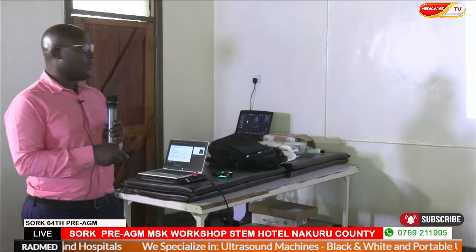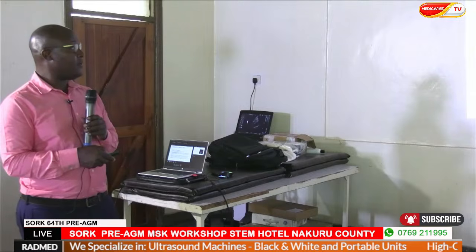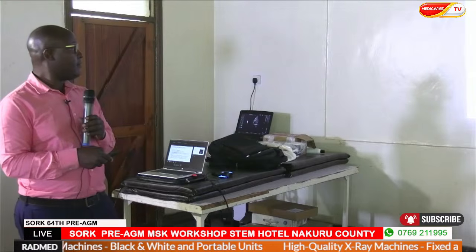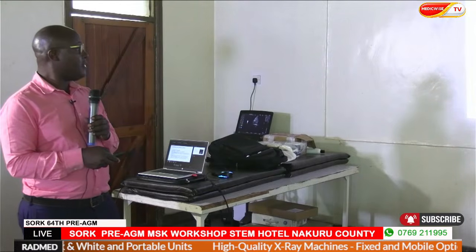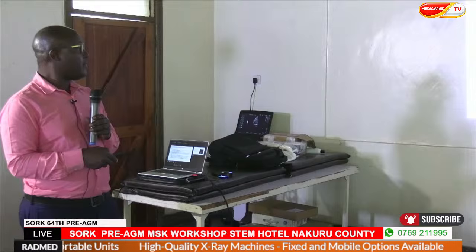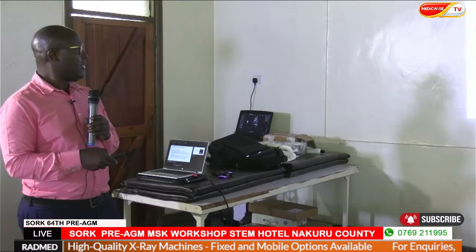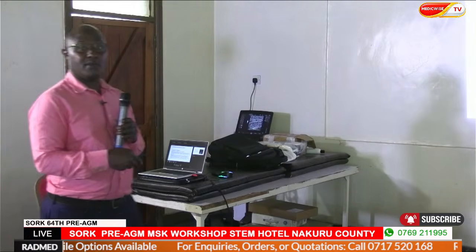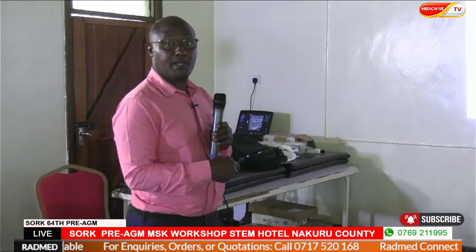So let's look at anatomy of the bursa. Normal state, not usually discernible at ultrasound. When distended with fluid, anechoic fluid between the hyperechoic tissue layers, adjacent structures appear as hyperechoic fat planes and capsule. So this tells you that when you see a bursa in a location where you expect it to be, and you can discern it with ultrasound, that is already an indication of a pathology called bursitis.